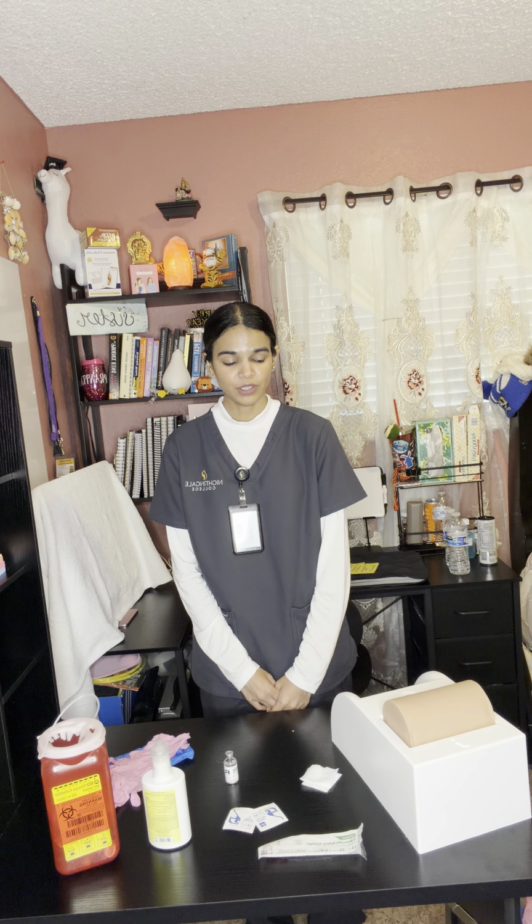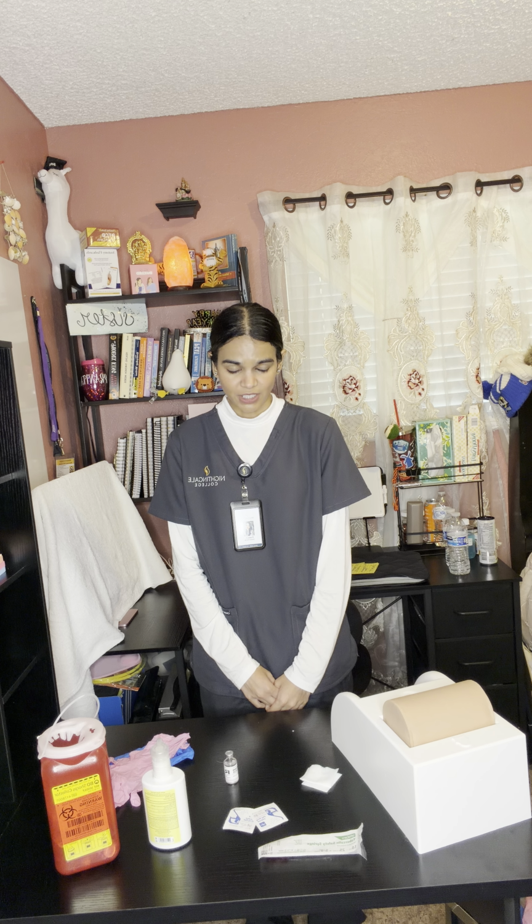The next thing I'm going to do is ask the patient if they have any allergies. The patient denies having any allergies. I will then tell the patient that I am here to administer a tuberculin injection. The tuberculin injection allows for detection if a person has been exposed to tuberculosis.